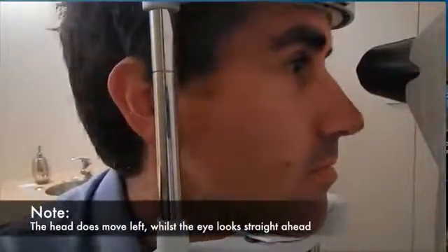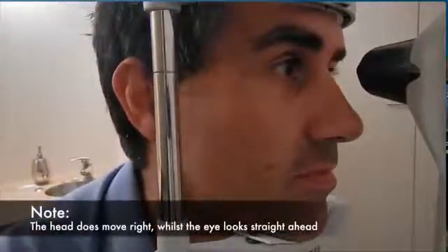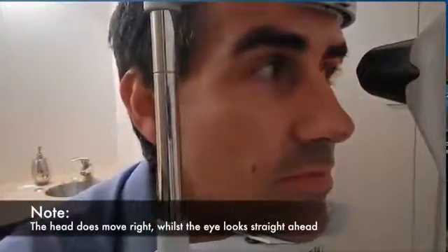The head may also need to be manipulated horizontally to achieve the ideal scenario for capture, where the cone is sufficiently close for capture. As shown here, the head may need to be tilted to the left, or to the right.